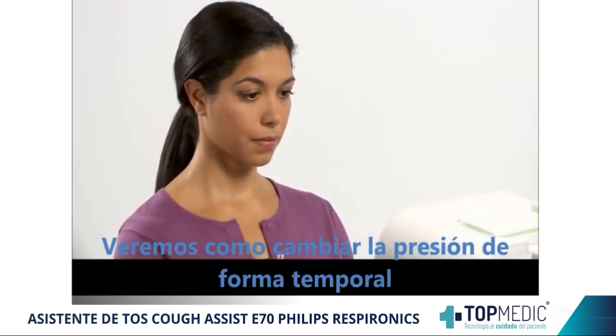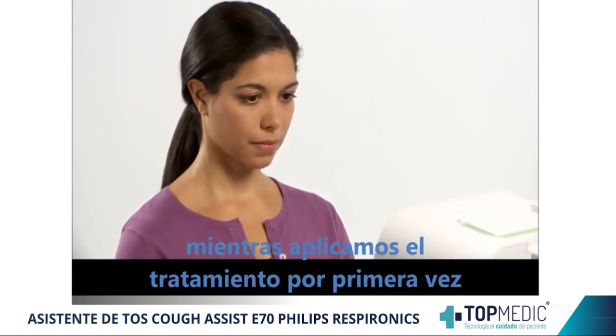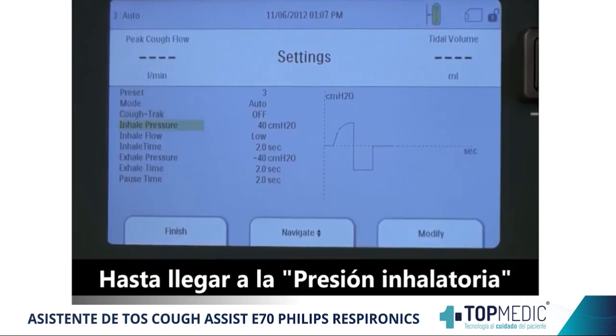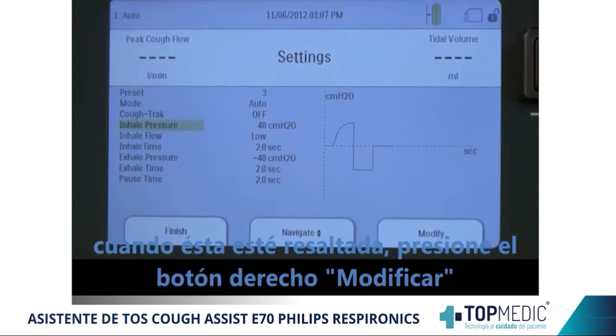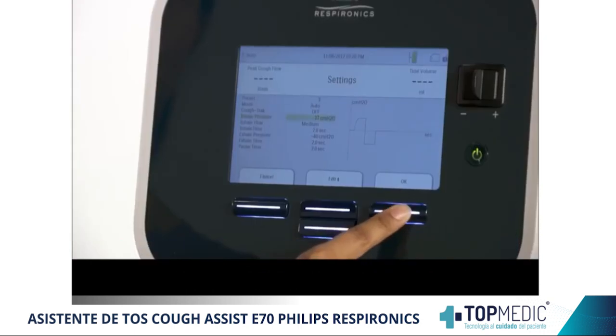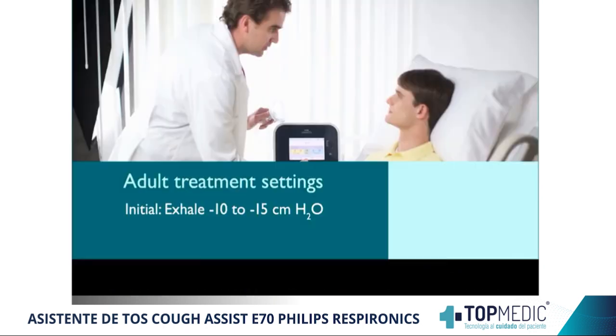Let's say you want to change the pressure temporarily while a patient is being introduced to treatment for the first time. Use the center Up-Down button to move down the list until inhale pressure is highlighted. Press on the right button under Modify. Use the center Up-Down button below Edit to lower the pressure to the new setting.